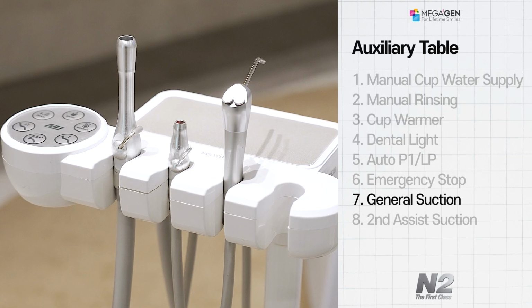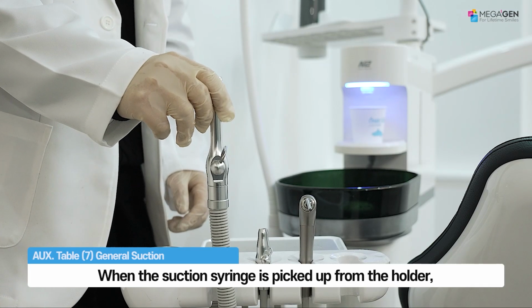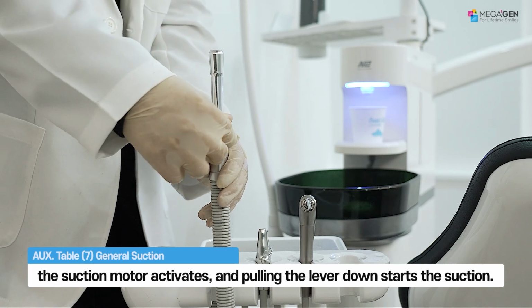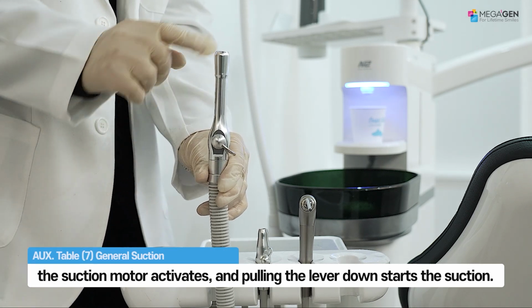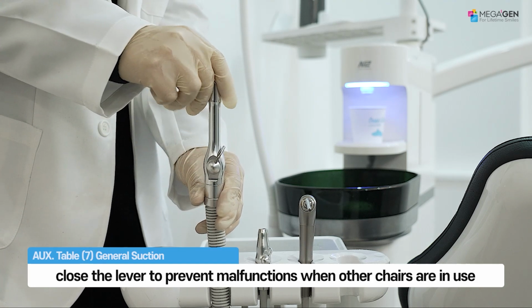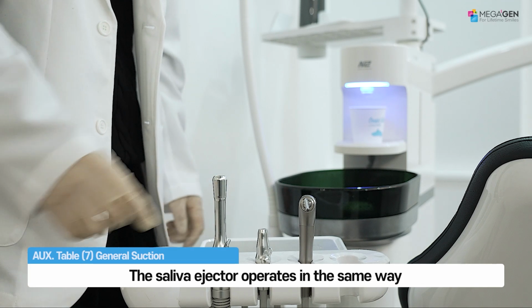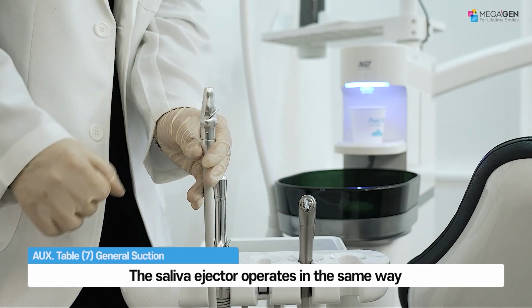How to use the suction. In general, the chair comes with both HVE and saliva ejector. When the suction syringe is picked up from the holder, the suction motor activates, and pulling the lever down starts the suction. After the procedure, close the lever to prevent malfunctions when other chairs are in use. The saliva ejector operates in the same way.